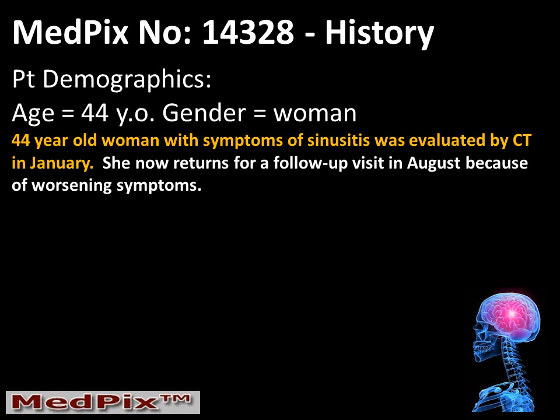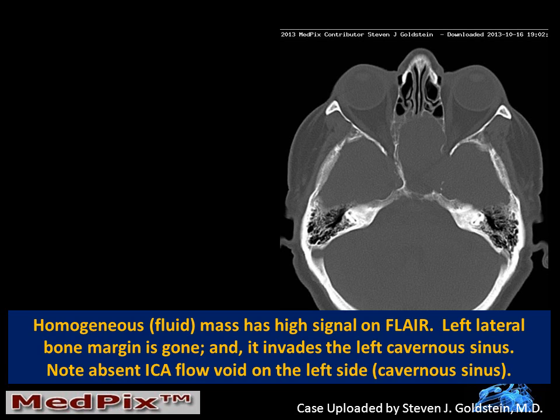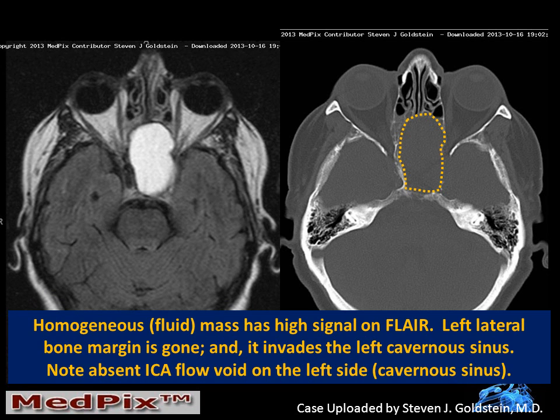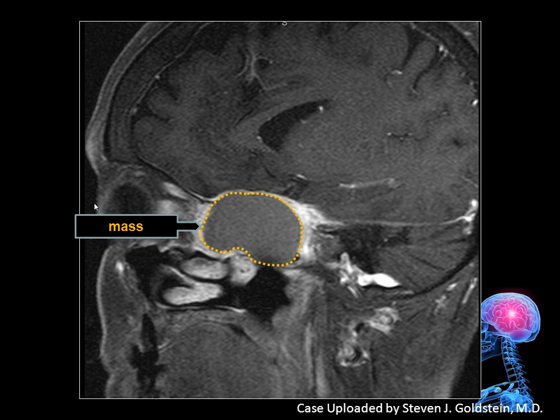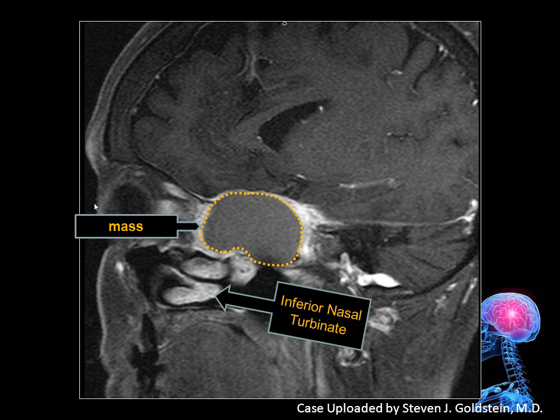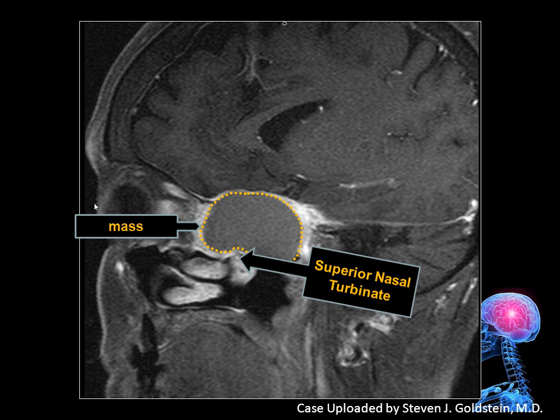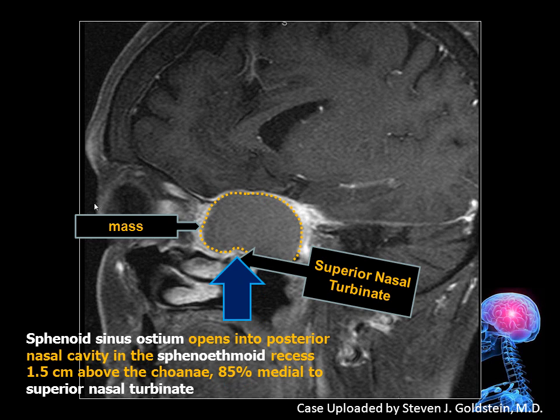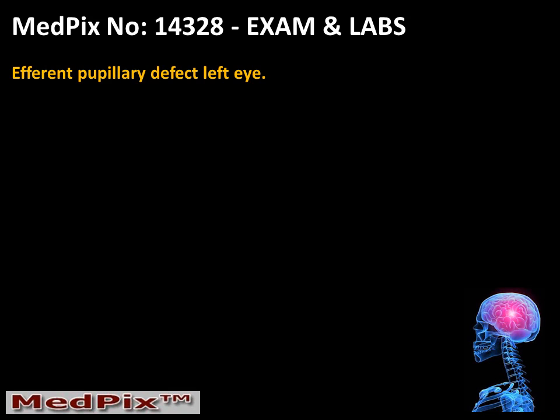Our patient returned for a follow-up visit in August because of worsening symptoms. We can now see that the sinus cavity is further enlarged, and there is high attenuation material accumulated within the sinus cavity. We have lost part of the bony margin in the left middle cranial fossa in the area of the cavernous sinus. On the sagittal image, we can see the mass with homogeneous fluid signal, and we can see the inferior, middle, and superior nasal turbinates. This is the location for the sphenoid sinus ostium, just medial to the superior nasal turbinate. Our patient now has a new afferent pupillary defect in the left eye.